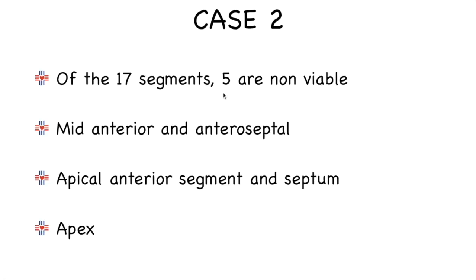In our report, we would say that of the 17 segments, five are non-viable: the mid anterior and anteroseptal segments, the apical anterior segment, apical septum, and the apex — which was also thinned and akinetic. This can be confirmed on four-chamber or two-chamber delayed enhancement images.